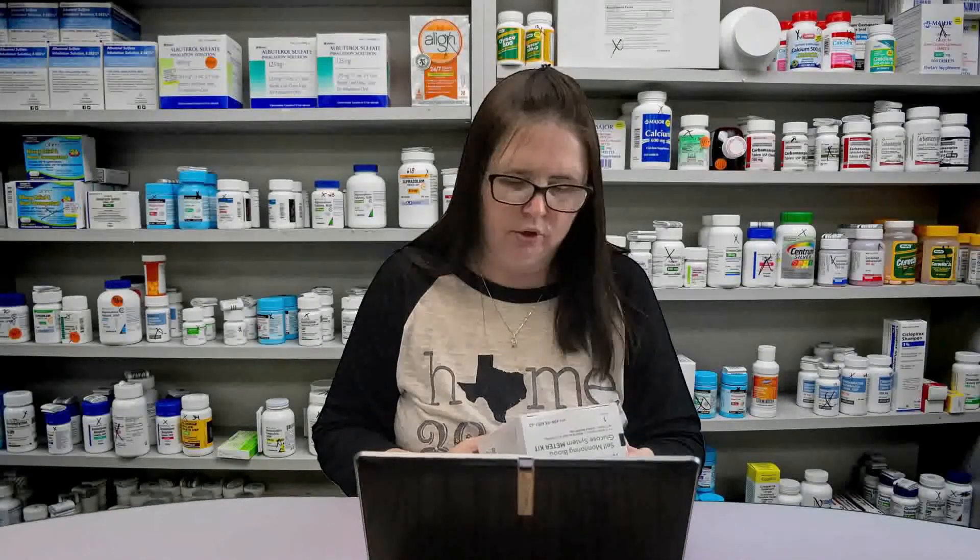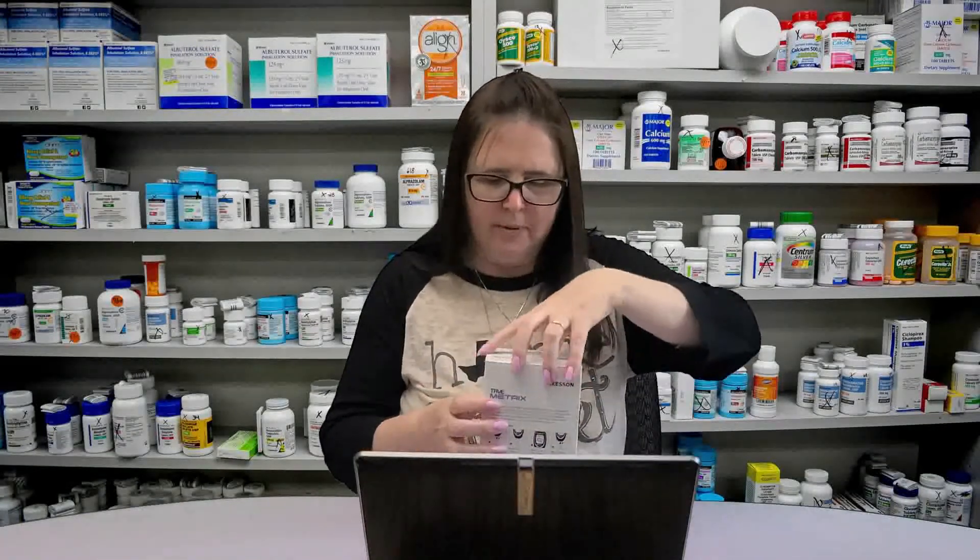Mr. Davidson, your doctor has prescribed you a glucose meter along with test strips, lancets, and control solution. You're going to need to test yourself three times a day, and your prescription has three refills on it. Would you like for me to show you how this works? Yes please, I really appreciate it. Okay great, no problem, it's what I'm here for.